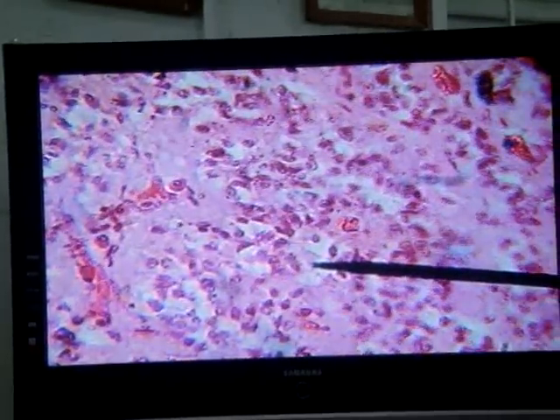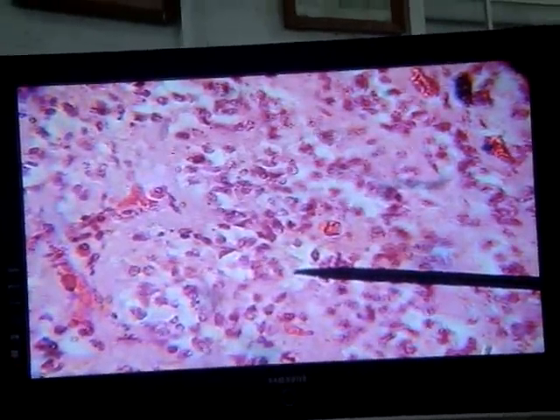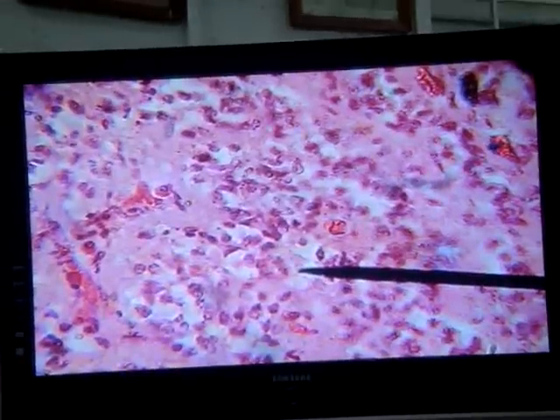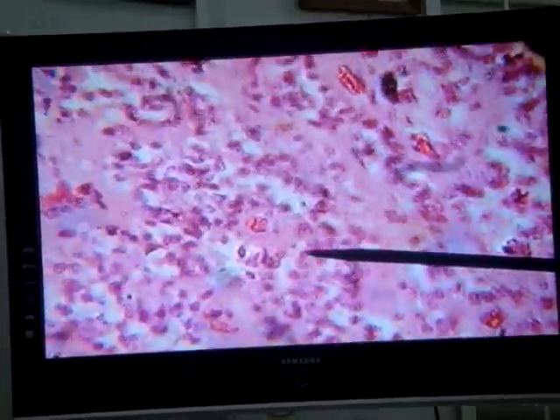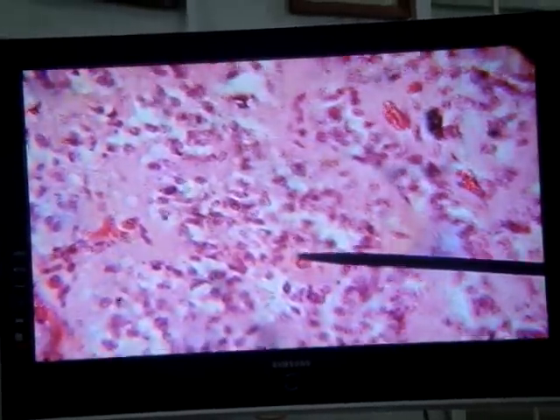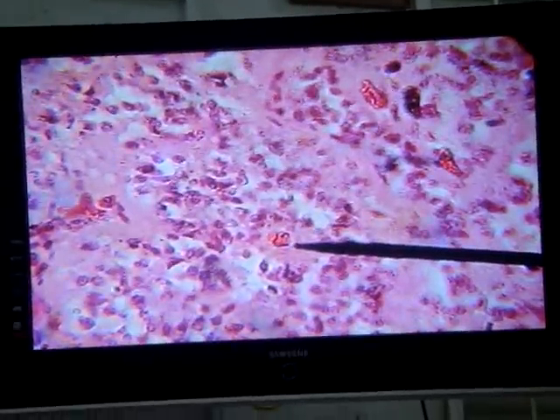Now, the parenchyma of the gland is organized pretty much like how all the endocrine organs are organized. Look at that. Clusters of cells, or what we call cords. So the cells are organized into cords. And again, note that associated intimately with these cords are numerous capillaries. Right at the tip of the pointer, you will see one.